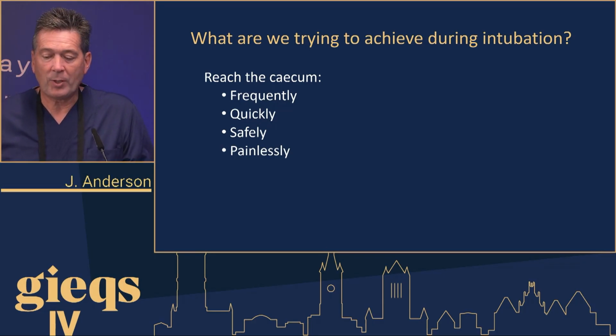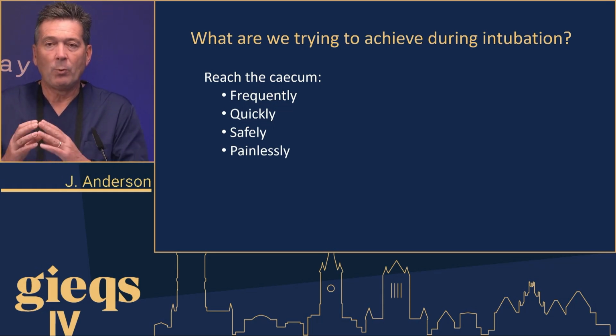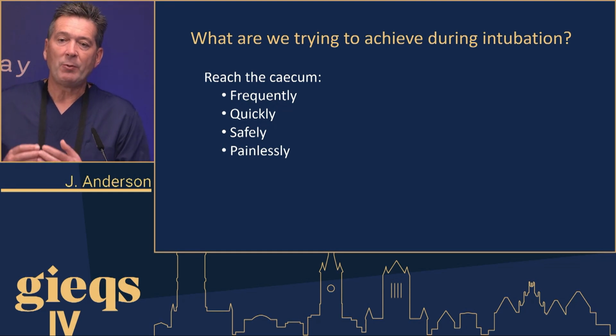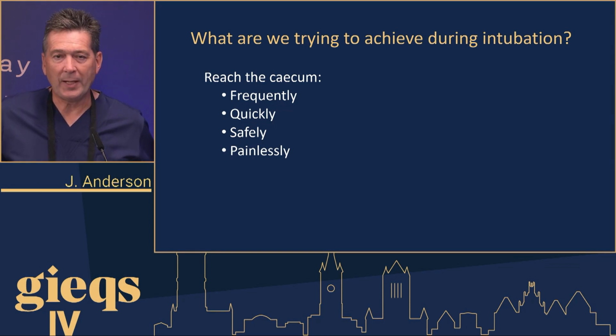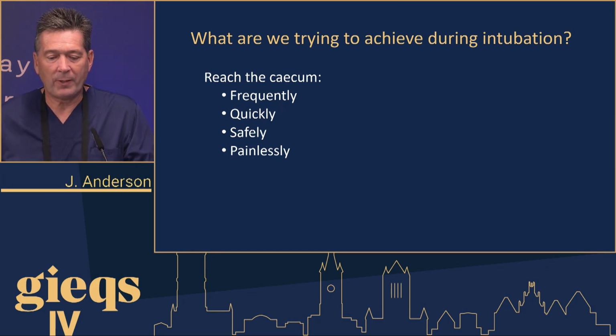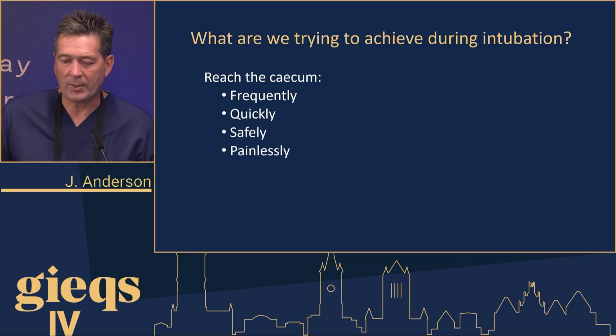And if you think about what we're trying to achieve during intubation, we want to do it as many times as possible. We want to do it as efficiently as possible, and that translates into speed, so you're quick, but equally you want to be safe. And you ask the patients, it wants to be painless, and it's not just the patients who want it painless. Trust me, the endoscopist also wants it to be painless, so you have a calm, controlled environment. And I think this technology not only allows you to help understand the solutions to the problems you're facing, but also helps make the intubation much less uncomfortable.